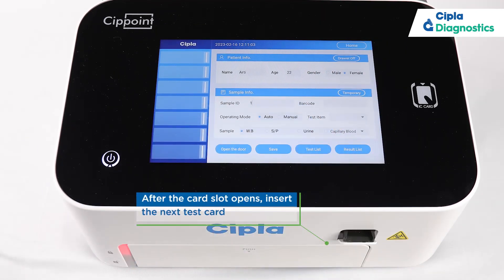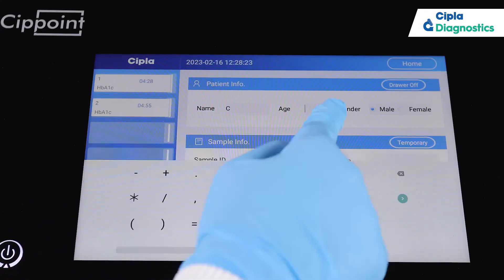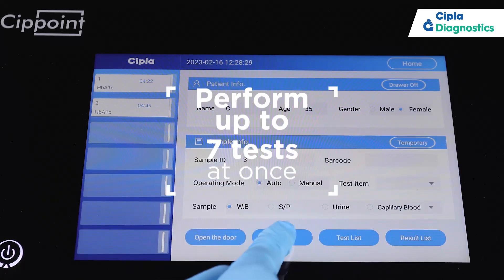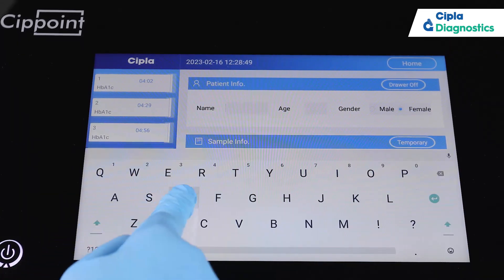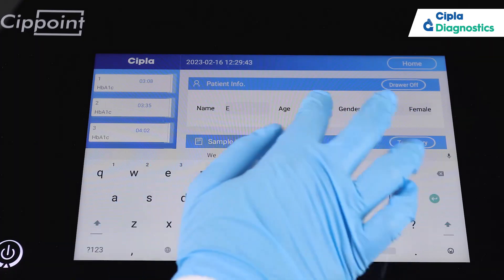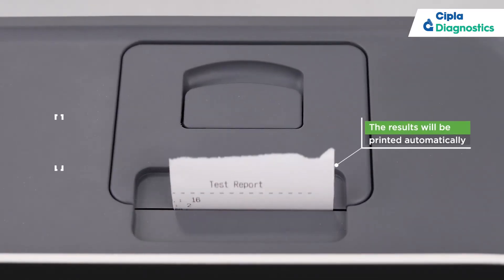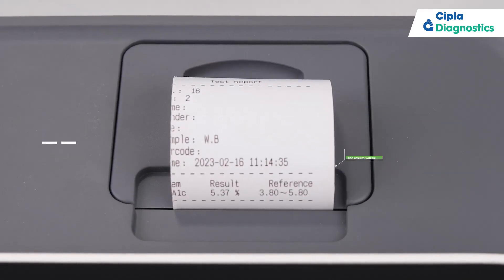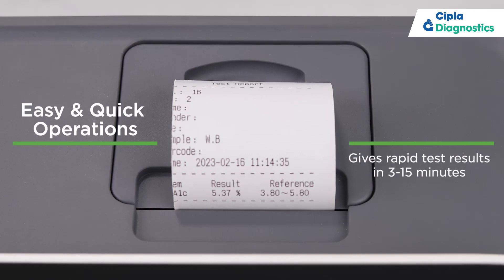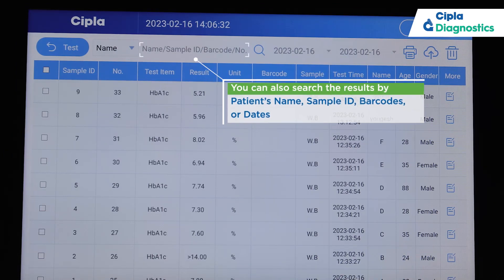Insert the test card into the card slot — the Cippoint system will recognize the test items automatically. After the card slot opens, insert the next test card. After the test is performed, the results will be printed automatically. Tap Result List to check and verify the test results.